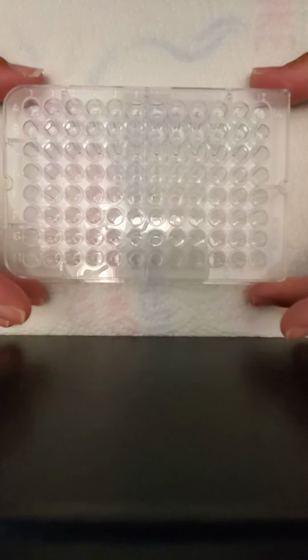We should see a color change happen within the next 5 to 10 minutes. So we have to let this actually sit. The reason it's on this whitish paper is so that we can see a color change if it starts to occur.